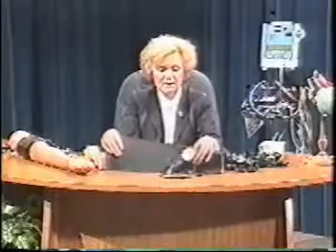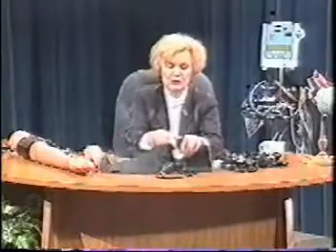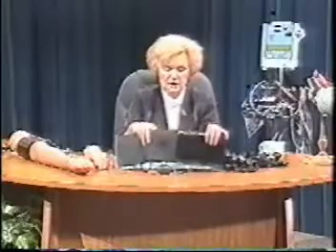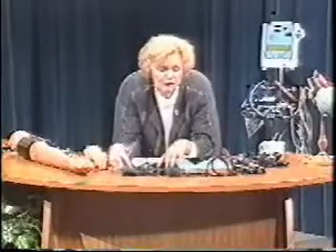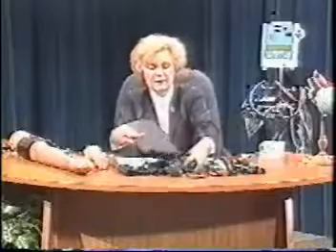These cuffs come in different sizes, and it's important to use the correct size because you will get an inaccurate reading if the cuff is too narrow or too wide for the individual's arm. I have a couple of other cuffs here. This one you can see is much smaller. This is a pediatric size cuff, and would be used for a small child. This one that I've shown you is considered an adult-sized cuff. The other one is a very large cuff.